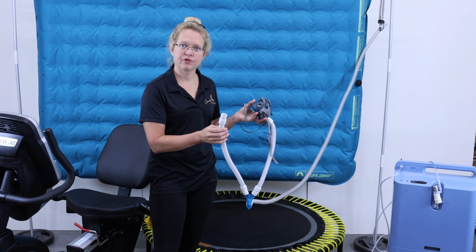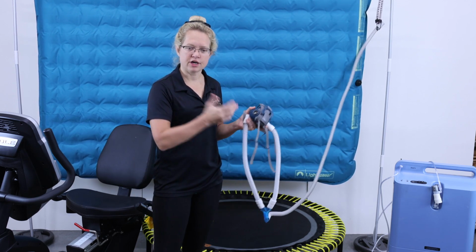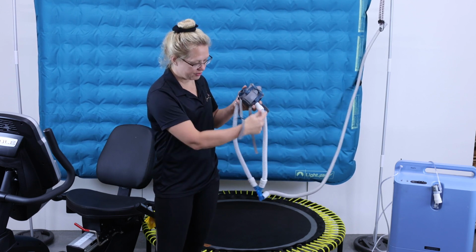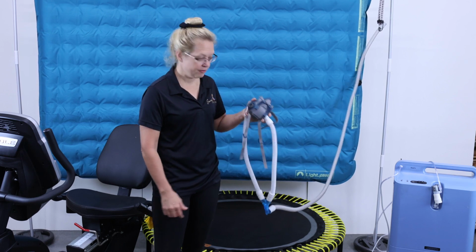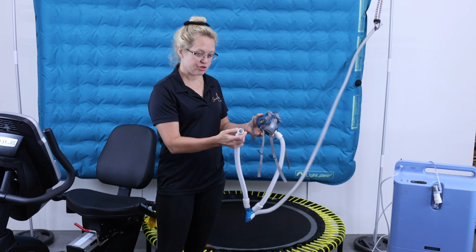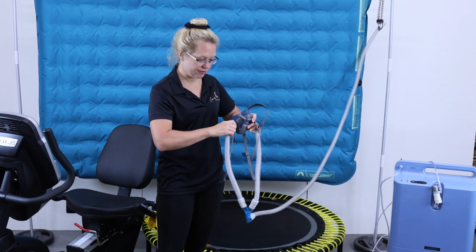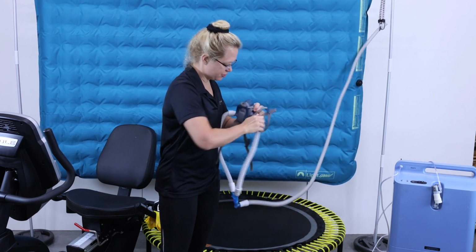And if you don't know what a CPAP is, it's hoses that people use for pressurized air when they're sleeping, so they can sleep with sleep apnea. CPAP hoses are very common, and I bought these two, I think they're 18-inch hoses, online. It's very inexpensive. And then I bought a 6-foot CPAP hose online. It's a soft rubber end, so it fits perfectly on the 3M mask. So you put it in pretty good, and you put this one in and make sure it's in pretty good.